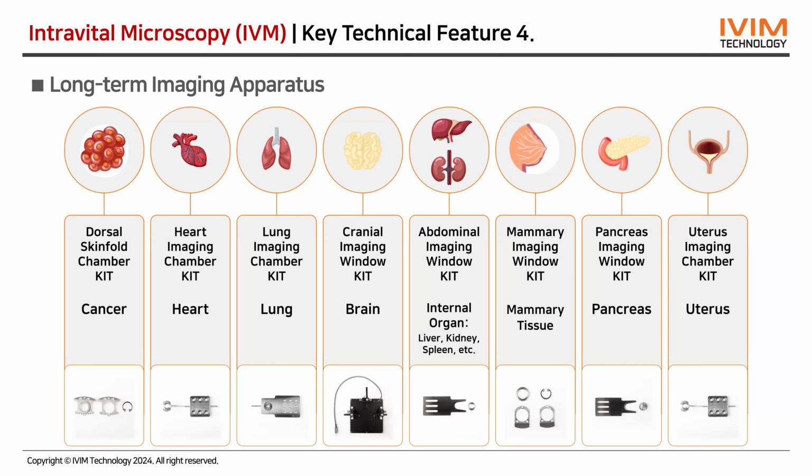Through this apparatus, we could successfully obtain heart and lung imaging data using a specialized imaging chamber with a tissue motion stabilizer to hold the tissue very still, to reduce the artifacts induced by heartbeats and breathing. In the case of imaging the liver, kidney, and other abdominal organs, we could implant this abdominal imaging window on the abdomen, which lets us acquire long-term imaging data for up to almost 2 months.